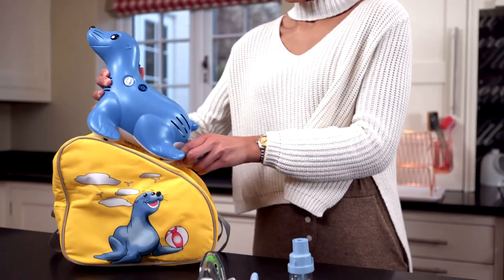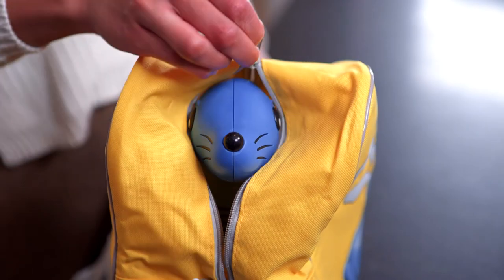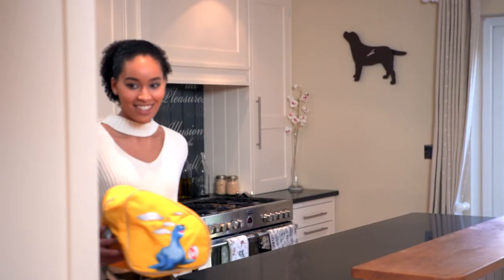Between uses, Sammy the Seal and the accompanying accessories can all conveniently be stored in the bag provided.